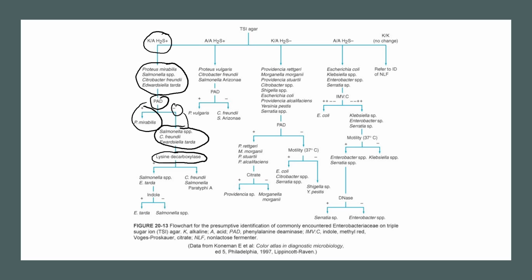If you want to learn more about lysine decarboxylase, such as the use of lysine iron agar, I would refer you to figure 9-6, page 187 of your textbook. And lysine iron agar is a common test that is included in the battery with TSI, citrate, urea, sometimes PAD. So it is important sometimes to know the different kinds of reactions that you will find in the most commonly used biochemical test media in the laboratory.